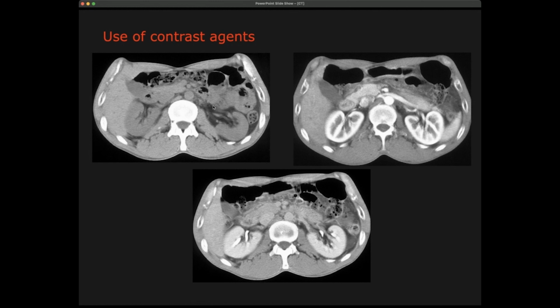If we now inject contrast in a blood vessel, what we start to see is that this aorta and surrounding blood vessels become white. That's because the contrast is in the blood vessels. Here you see that this structure is now white, while it is very unlikely that it's bone. We don't have a bone with a circular cross-section in the middle of our body.